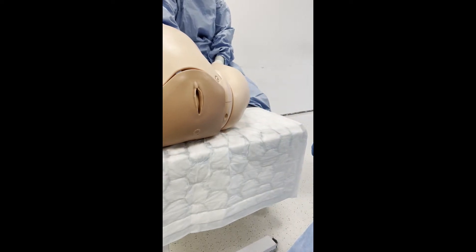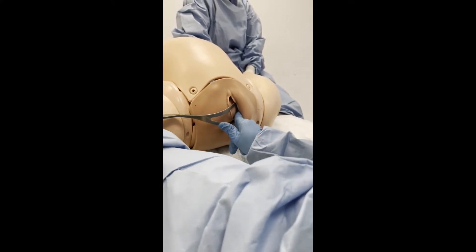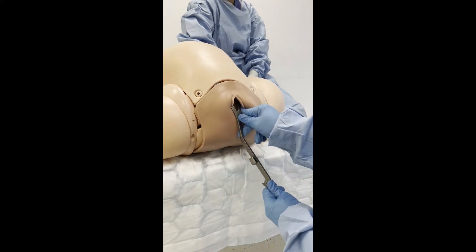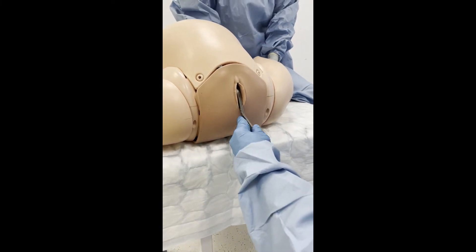The anterior forcep is introduced along the pelvic side wall in the manner of non-rotational forceps. The blade is then guided over the fetal face until it comes to lie in position under the pubic symphysis. The assistant holds the anterior forcep in place.